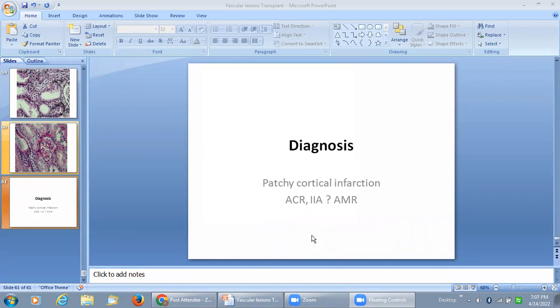And we have to remember that eosinophil presence could be related to interstitial nephritis also, because if the patient is taking some antibiotics and all that stuff, you can find some eosinophils. But always remember, if you find tubules with RBC cast, if you find some eosinophils, try to look for evidence of any endothelitis. Because that endothelitis, if it responds to steroid, then it is fine. But if it is not responding to steroids, then it could be a manifestation of acute antibody-mediated process. And always remember, vascular lesions are very commonly seen in acute antibody-mediated rejections.